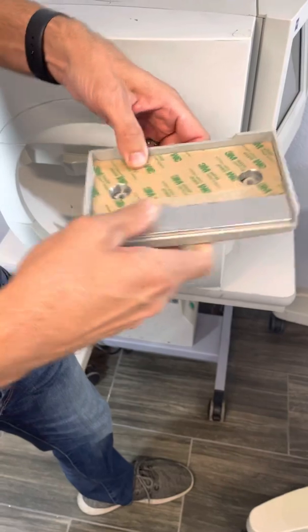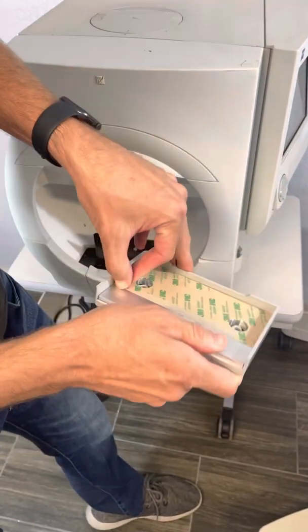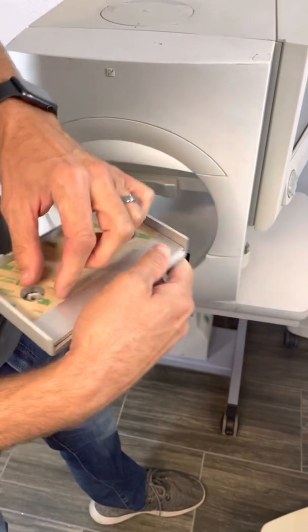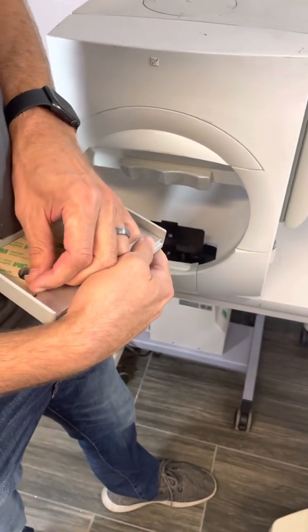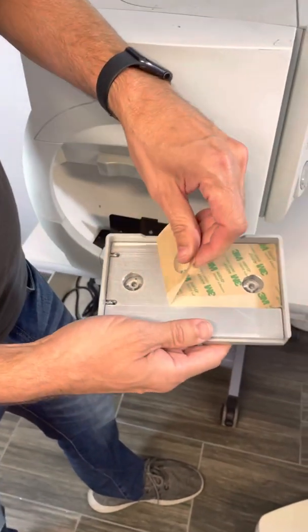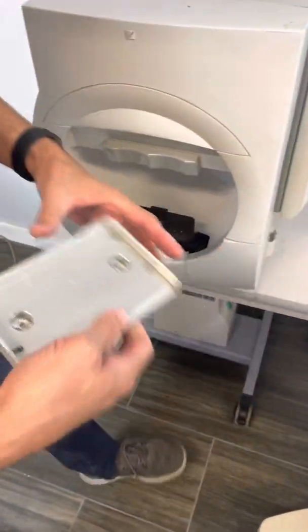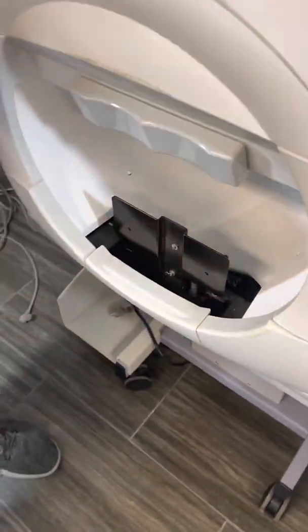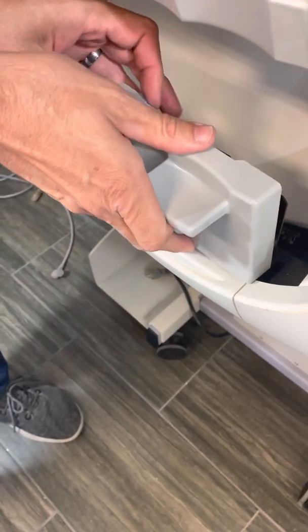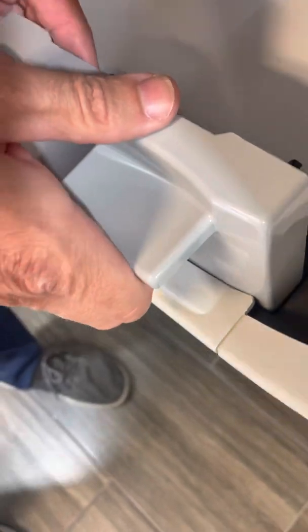I'd also recommend that you have the brown cover already loose before you pull it out. Now pull off the brown cover. Make sure the top of this is aligned to the top of that, then put it in and make sure it's resting on the top.